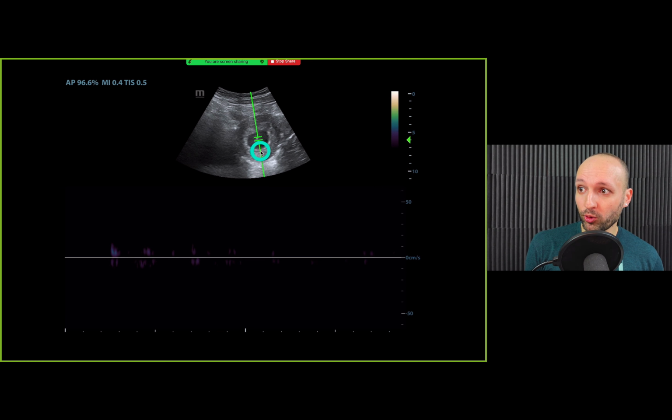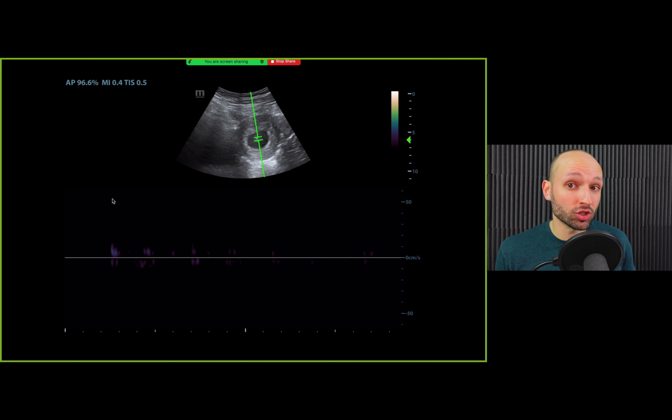This is a pulse wave Doppler gate, which is how I see a lot of people often try and measure the fetal heart rate. I would highly suggest, if you are able, to not use pulse wave Doppler, but instead to use M mode. The reason why is that although there've been no, as far as I know, reported harms associated with using pulse wave Doppler, the pulse wave Doppler actually does require a little more energy to be sent out from the ultrasound transducer. If you have more energy sent out, there is more of a potential for harm.